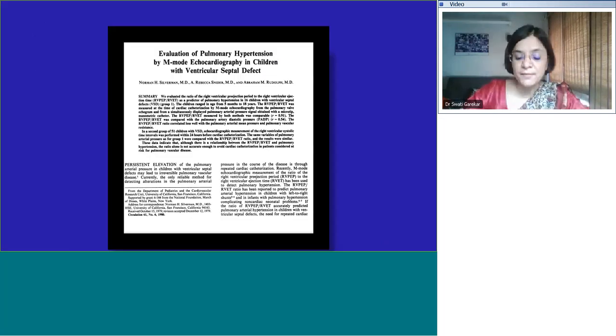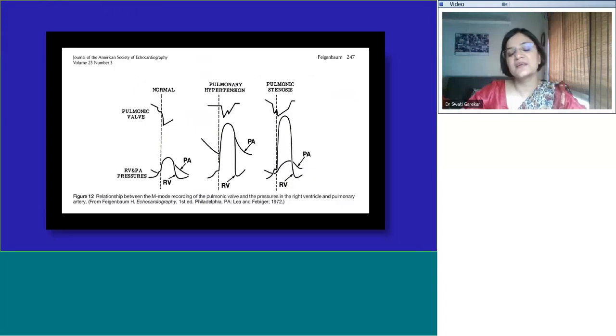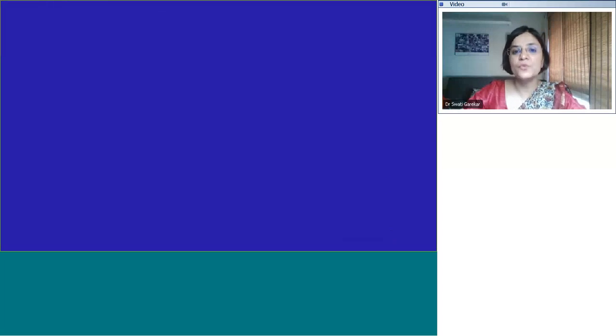Okay, so now we actually have no time. I'm going to skip pulmonary hypertension and M mode evaluation. I'm sorry, I don't do it. I did find literature about it, but seems to me there's enough data which says that it's not reliable. There are better ways, and I'm sure somebody will be covering PH evaluation in echocardiography for you.